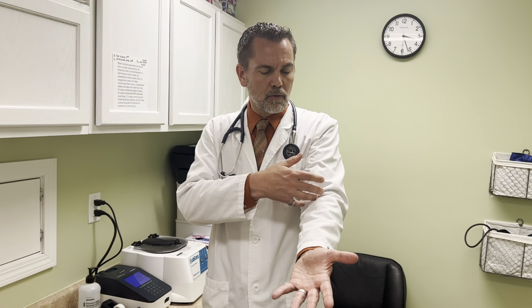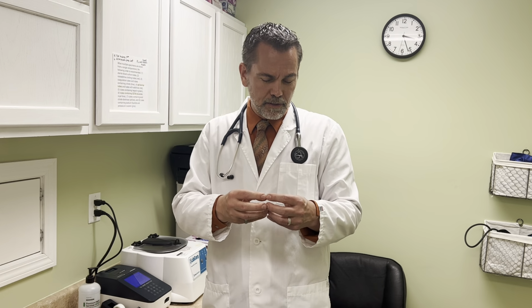So if you put a tourniquet on here, it creates a little bit of a barrier, and so it creates more venous pressure down distal or into the arm. So it allows the vein to kind of bulge up a little bit. It allows the blood draw to go a little bit more easily, so that we can get blood out in a more timely manner. We also sometimes use a variety of different tubes.